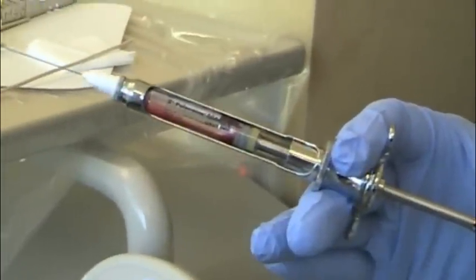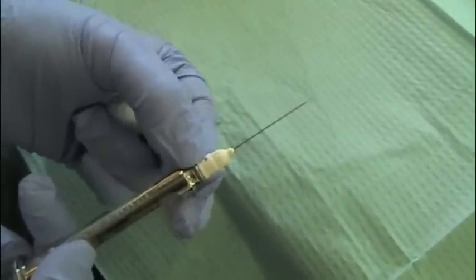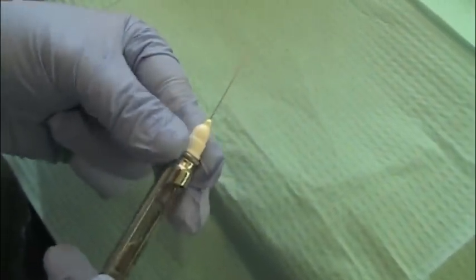This is an example of positive aspiration. When this happens, change both the needle and cartridge. Some needles have a bevel marker. This black dot on the hub identifies the bevel marker. If there is osseous, make sure this bevel is towards the osseous.